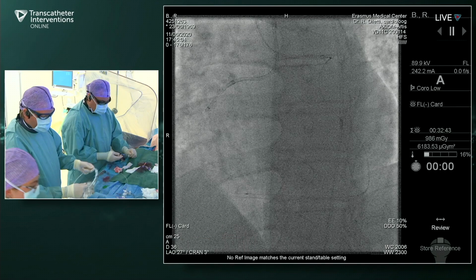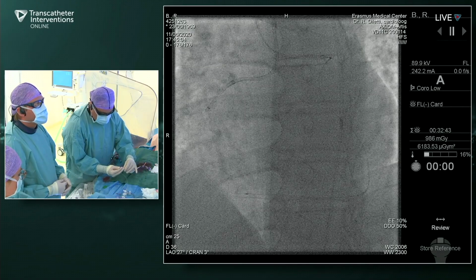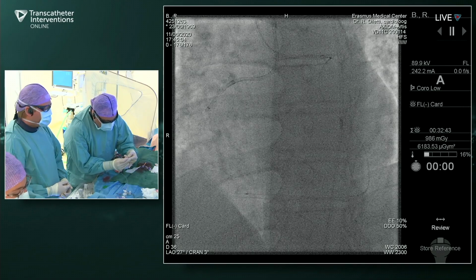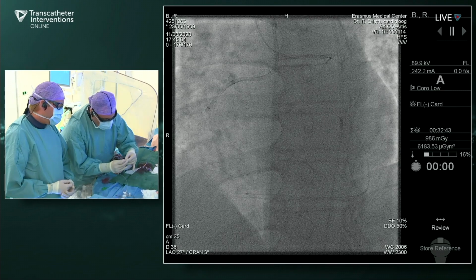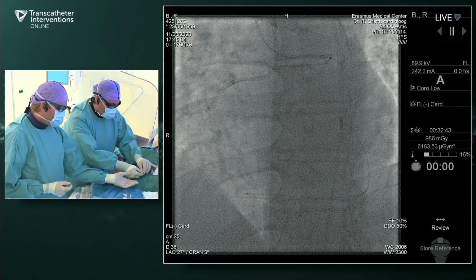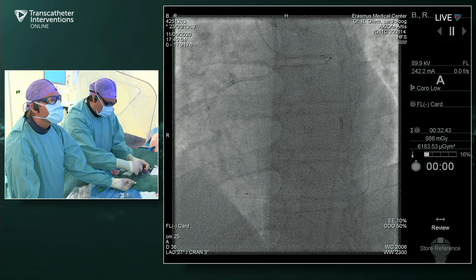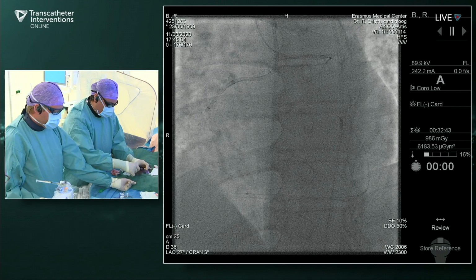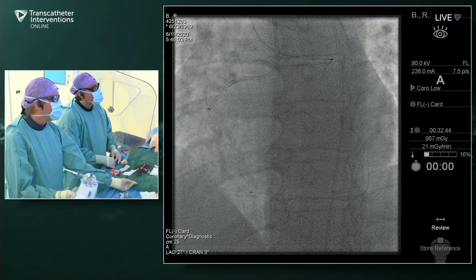And it's obviously important when you do that to watch your donor guide catheter doesn't get sucked into the donor system. And yes, he also leaves it in the distal right, so as to avoid, again, the microcatheter is now protecting the collateral. So he'll leave it there till pretty much the end, and then go from there. But he disengaged the guide first, I think, and then did it. Yes, the guide is a little bit still engaged.